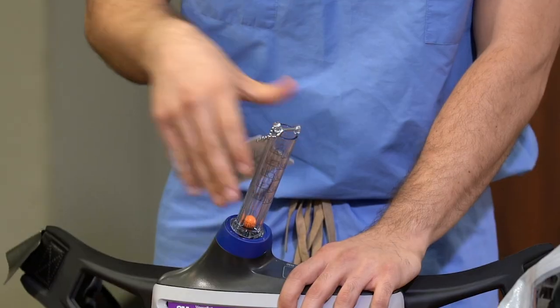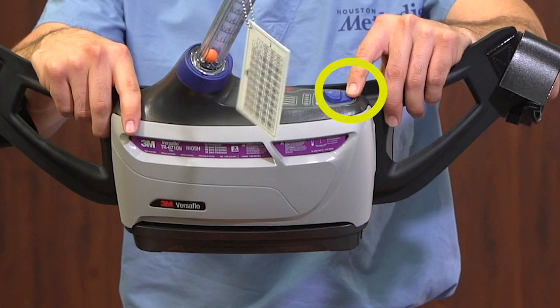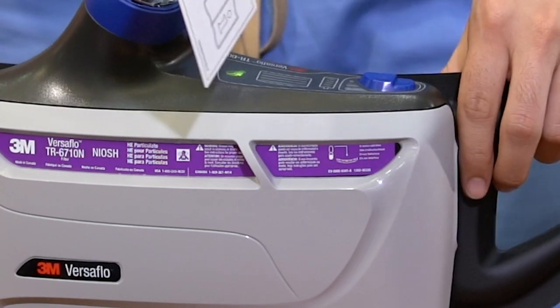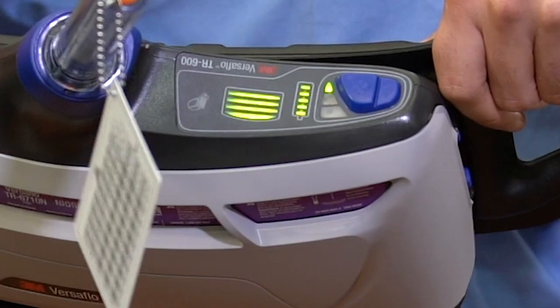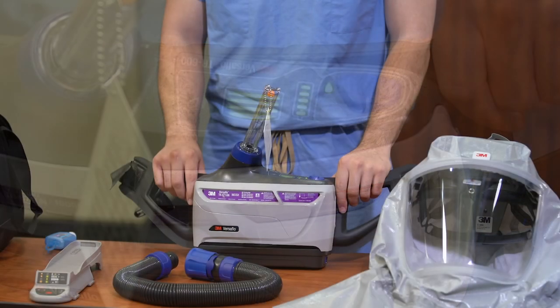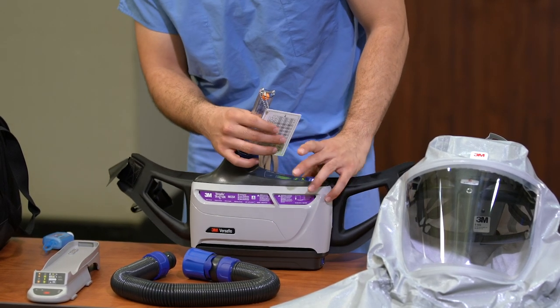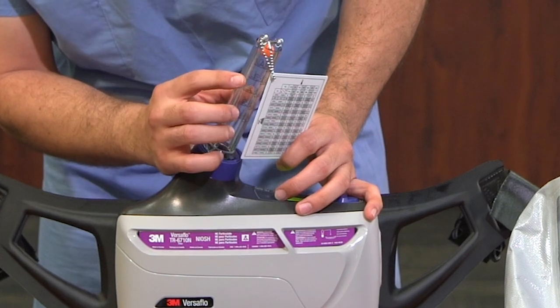Depress the blue on-off button located at the top of the device until the fan motor is engaged. The device will proceed through a startup phase, beep, and vibrate, and will also display the battery charge level. Ensure the battery is fully charged and the device is set to the lowest airflow setting. Watch the orange ball in the airflow meter and ensure that it floats at or above the F mark on the meter.